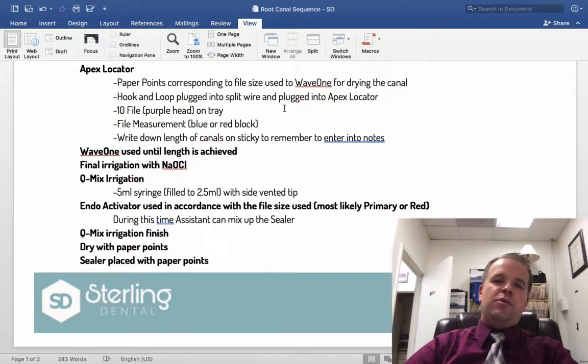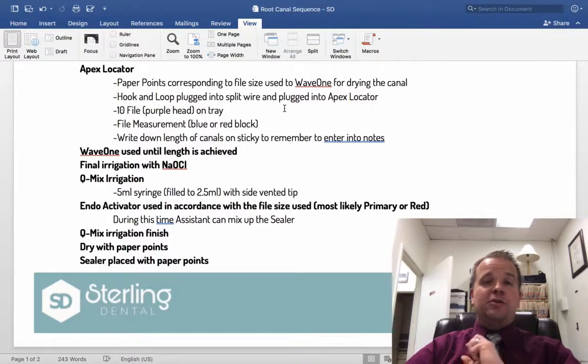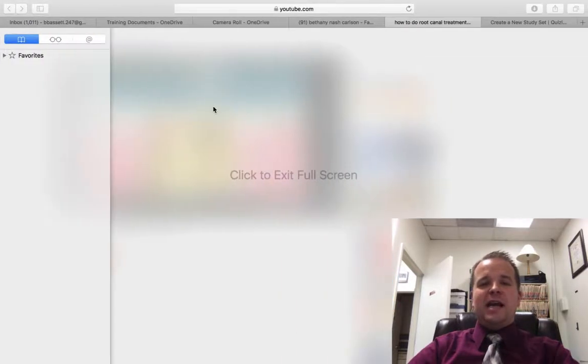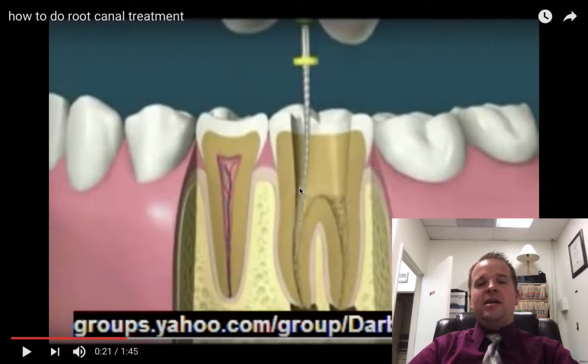So you'll do the apex locator, you'll find the exact length. Oftentimes, if the apex locator doesn't come out perfect, then you'll snap an x-ray in there. And this will be a type of x-ray that you'll have the sensor for, just to make sure that it can slide behind the rubber dam, not one that you would typically use to be able to take an x-ray. Then at this point, once you know exactly how long the canal is, then you'll use the wave 1 file to go all the way down to the end.